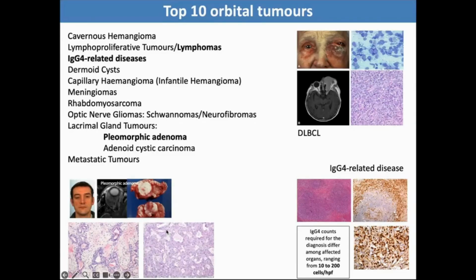What is important is to look for any malignant component either within the tumor or within the so-called pseudocapsule surrounding the specimen. And this is an example here of a carcinoma which has developed from an adenoma. Other lesions which are malignant include a diffuse large cell B-cell lymphoma.